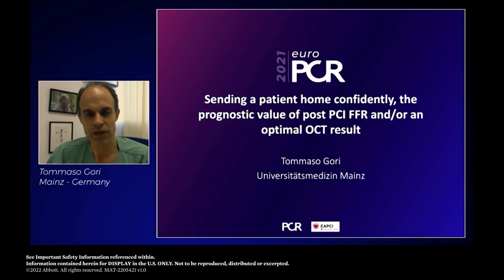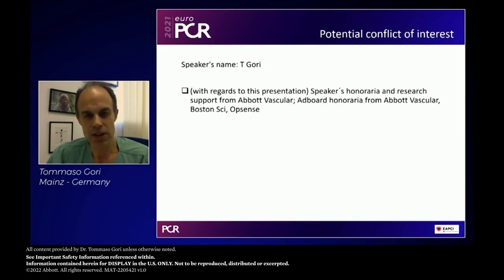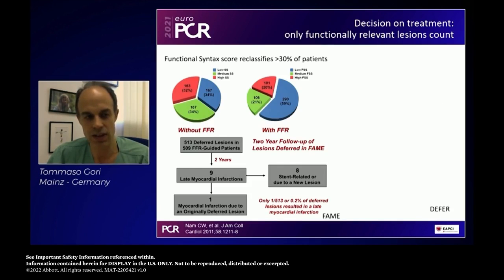Tomaso, please. Dear colleagues, thank you very much for the question and for allowing me to give a presentation at this EuroPCR. The question I'm asked to answer is, when do I feel confident sending a patient home after treating, for instance, a long and calcific stenosis? And often those patients are also the ones that have multiple vessel disease. So let me just explain this in a couple of slides. This is my conflicts of interest with regard to this topic.